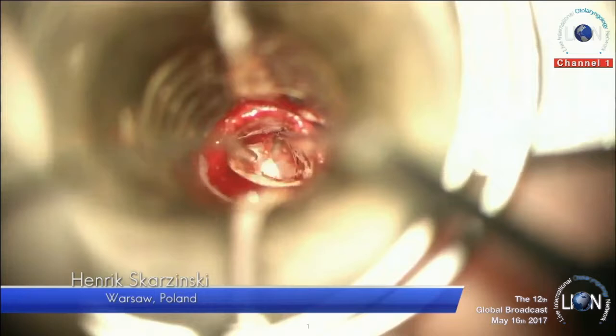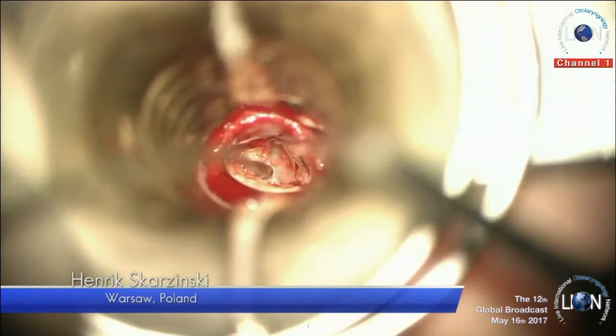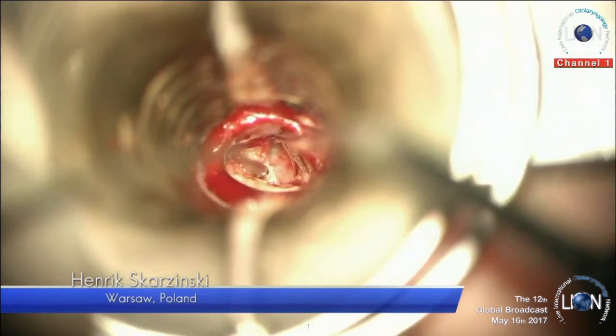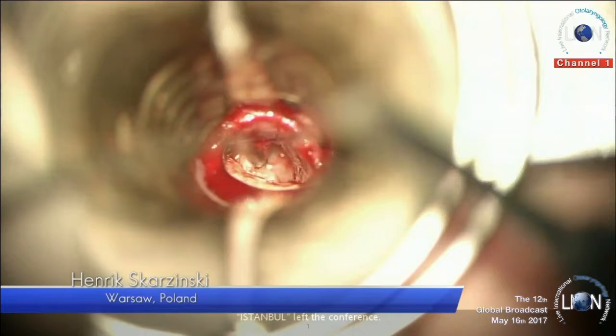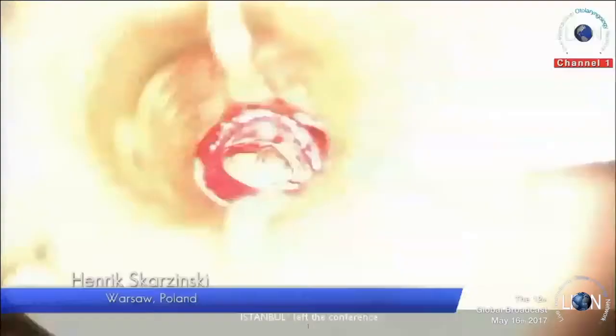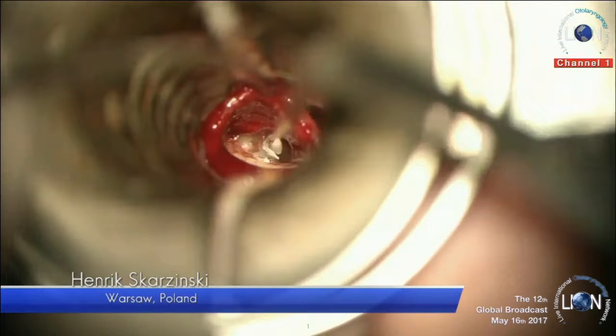It's always our first choice in such a situation — we first use the glass ionomer cement. And then, if after some years the results are not good enough, we could switch to a prosthesis. But honestly, that happens very, very rarely. Now we dry the cement. We would like to add some more cement for stronger connectivity, especially due to some distance between the ossicles.